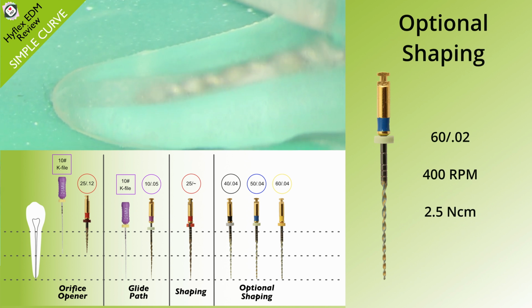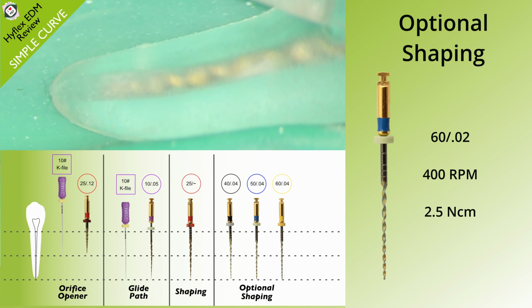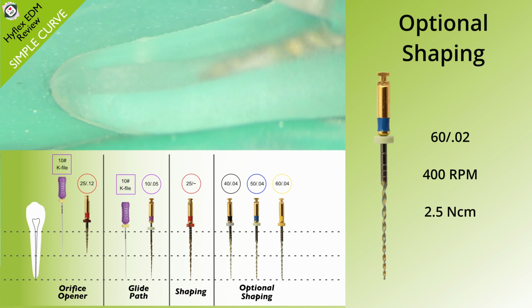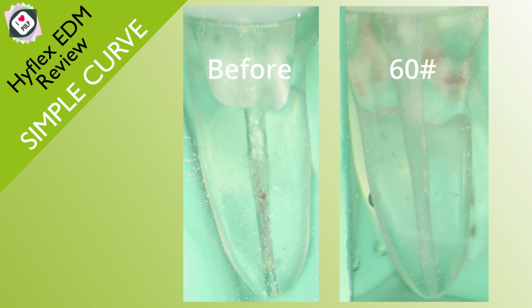And finally, just for demonstration purposes, we're going to use the size 60. Again, huge. And there we can see the before and after, which, as mentioned, I think is excessive. We could probably finish it on 25.